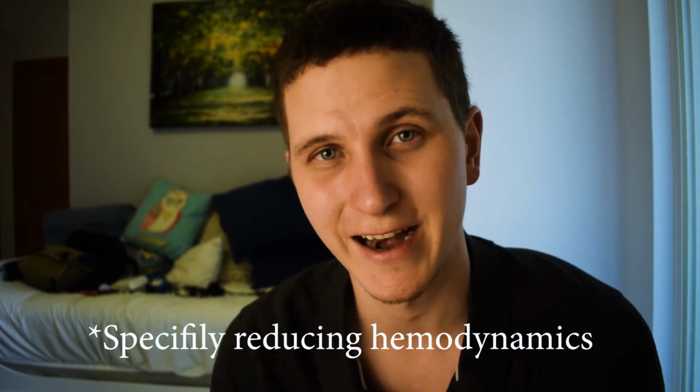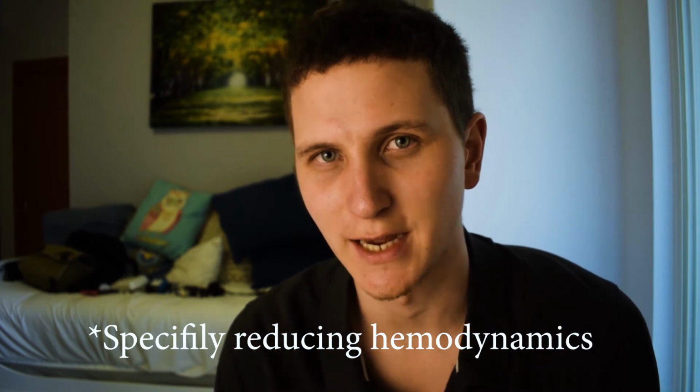So we're going to be starting with basic ventilation and ventilators. What's important to start off with is what is normal ventilation. When you're breathing, the volume in your lungs increases, so the pressure decreases and air rushes into your lungs. So it's a negative pressure ventilation, because you're making a bigger volume and air rushes in. When we put you on a ventilator, that's turned upside down. The ventilator pushes air into your lungs, so it does kind of a reverse of normal. That has lots of effects on the body, important to take into mind.